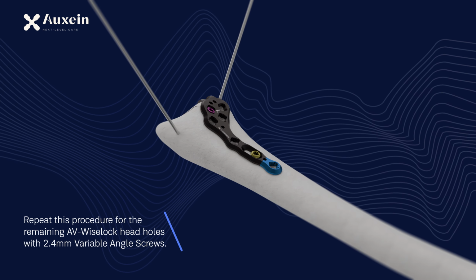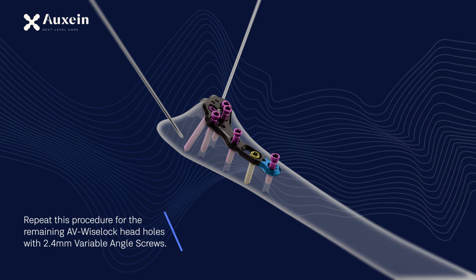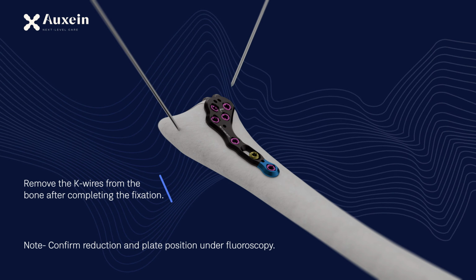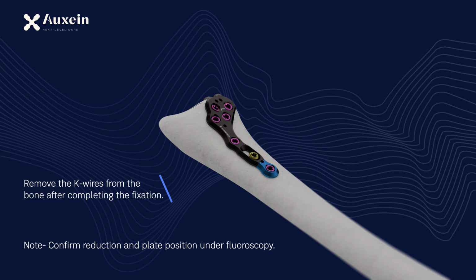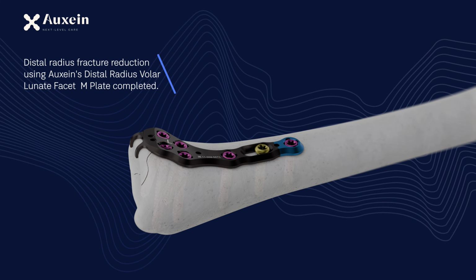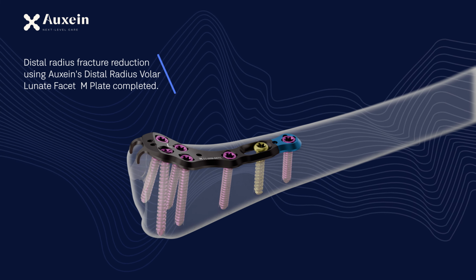Repeat this procedure for the remaining AV-Wiselock head holes with 2.4mm variable angle screws. Remove the K-wires from the bone after completing the fixation. Distal radius fracture reduction using Auxein's distal radius Volar Lunate Facet M plate completed.